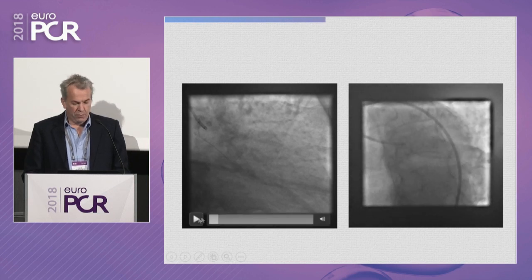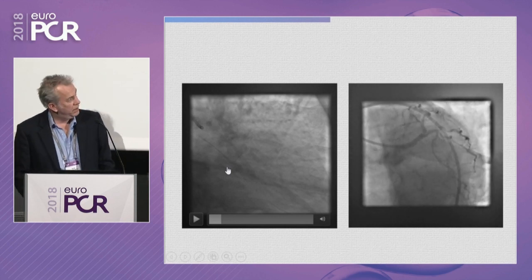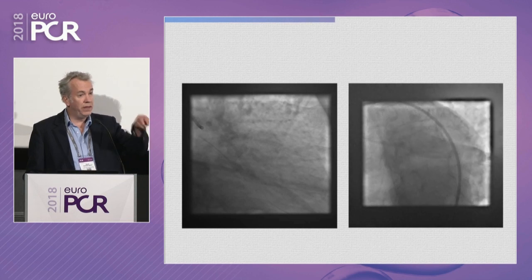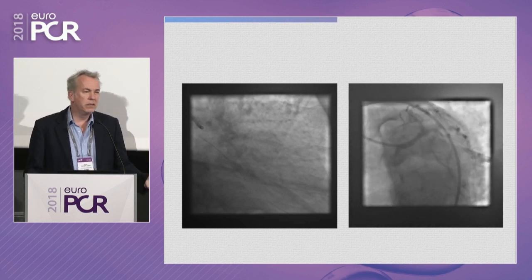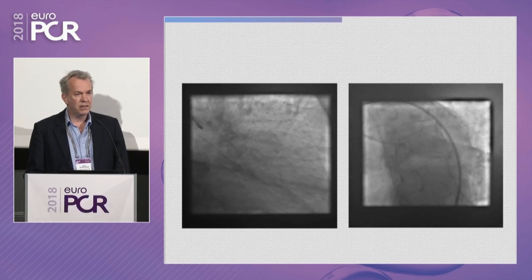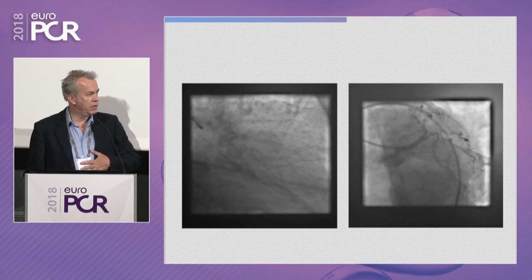Yeah, so the trouble with that, I don't know what other people think. Sorry, I can't get this left-hand film to play again. But on the left-hand, you saw there's extensive disease within the body of the distal left main. So V-stenting would essentially be SKS coming back into the left main. I can't express any enthusiasm for it myself.